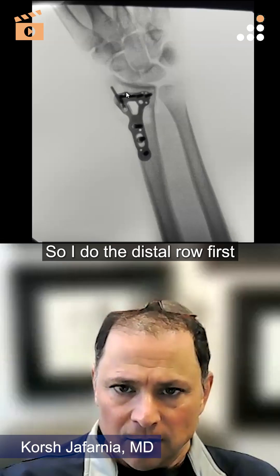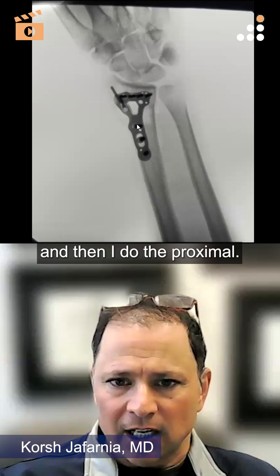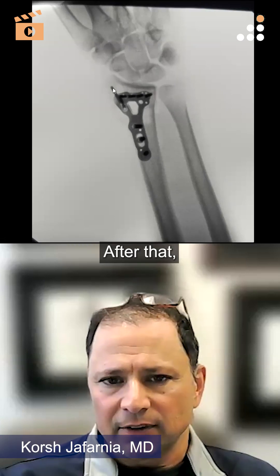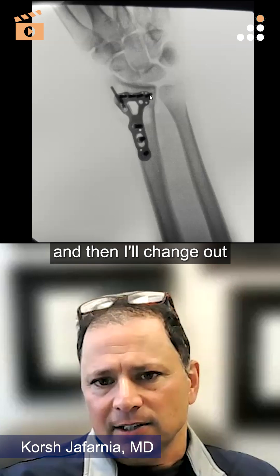I'll do the distal row first and then the proximal. I'll bring the plate down to bone proximally and then do the styloid screws after that, and then I'll change out the screw on the other side.